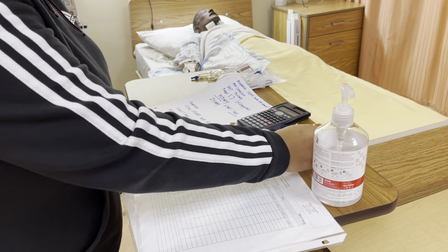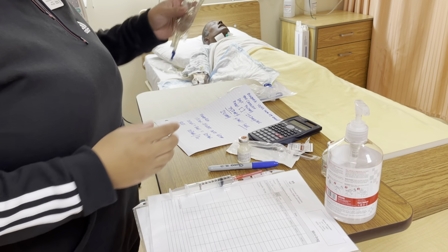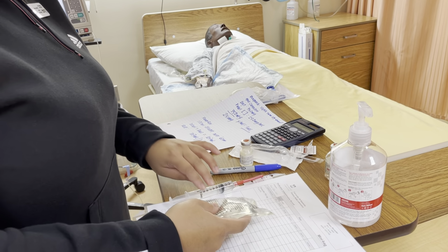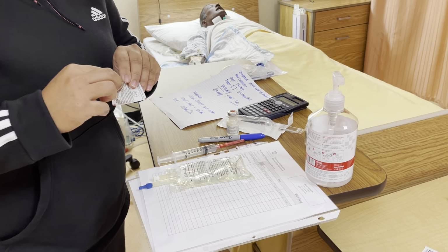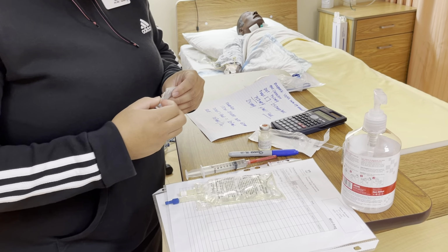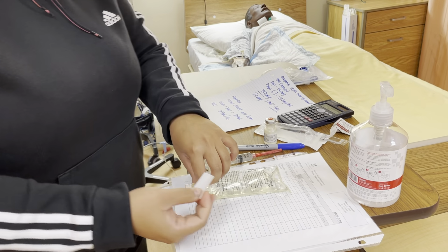So I've done my second medication check. We're ready to dilute the medication. Like I said, I chose to dilute it in 100 ml of normal saline. We're going to swab the port.